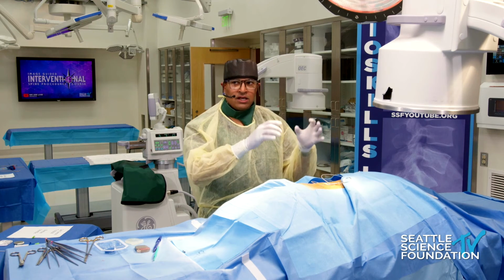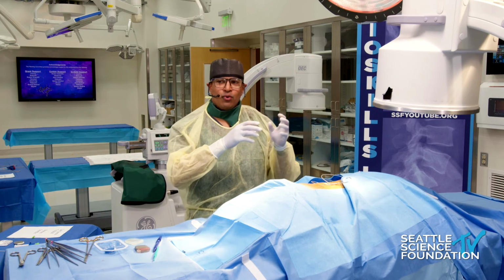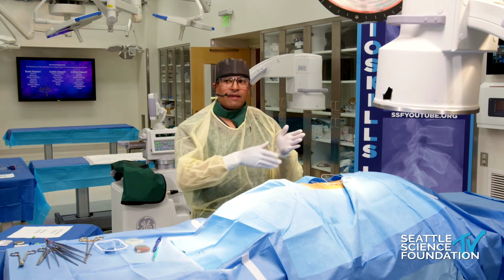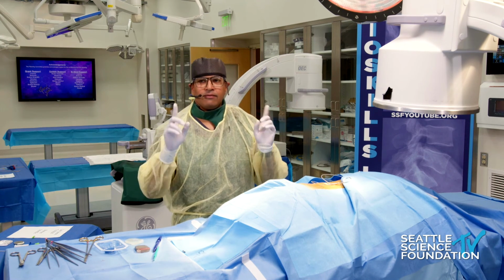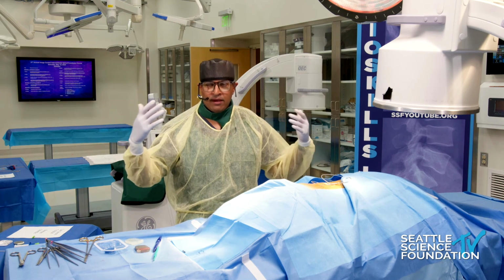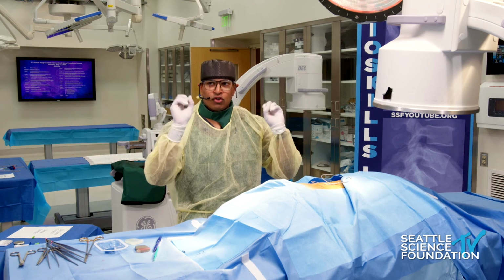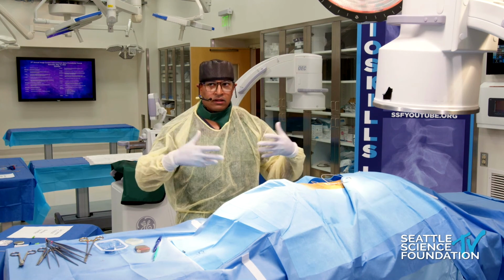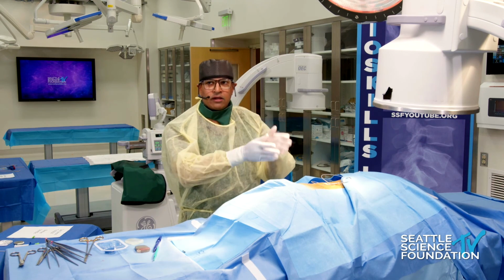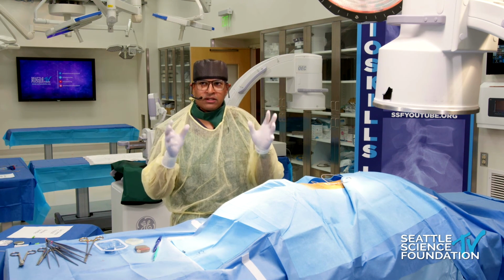What multi-phase does is it changes the anode cathode array sequentially down the spinal column. So different segments of the spinal cord are receiving electricity at a different time sequentially, and then that's cycling over. What that does is, number one, it reduces the amount of energy that is used. Key, right? So that allows for a longer period of time that the energy can run before it needs to be recharged. Number two, rather than applying the same electrical current to the same segment of the spinal cord, where habituation, changes in the glial cells, the cytokines, interleukins, et cetera, will manifest, adaptation is natural in the human body. So by changing where the electrical stimulation is along the spinal cord, you're not allowing that adaptation to occur. And that's what I think is really novel with this particular paradigm in multi-phase.